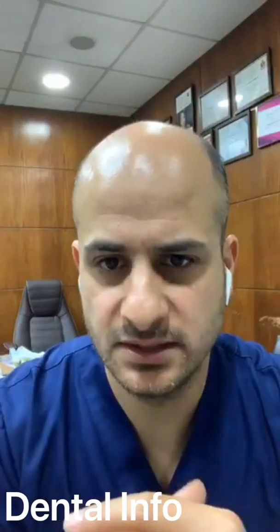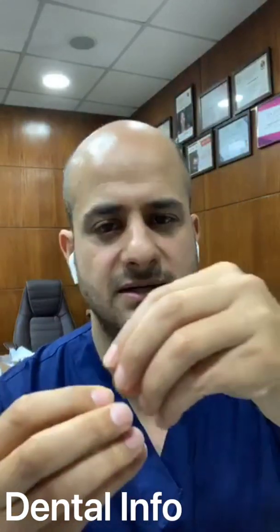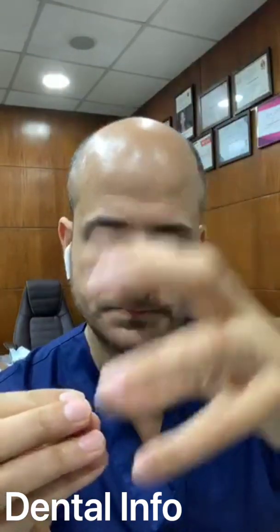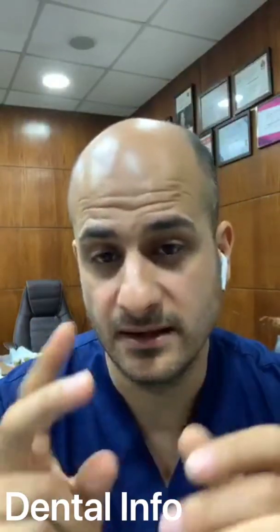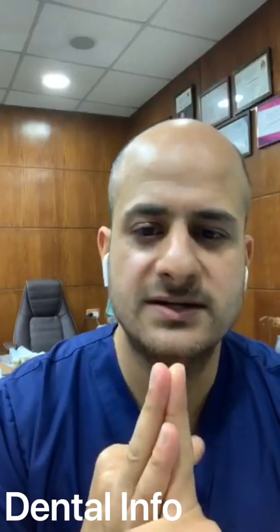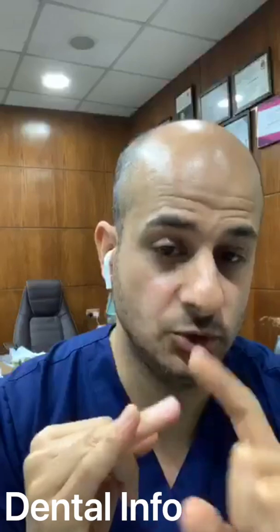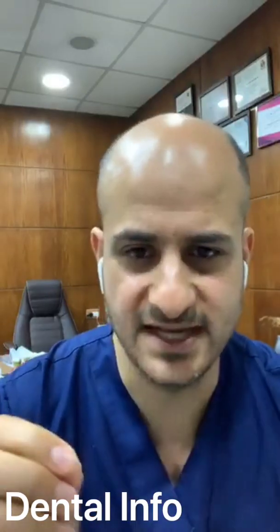How can we avoid sticking between gutta-percha and the plugger? I think Dr. Dua Halima is asking about when she goes out with the Fast Pack, the gutta-percha will go out with it. Okay, it's a common problem. We have a lot of causes. First, you don't have good tugback. Second, you are trying to pull out your heated plugger, I mean Fast Pack in this case, in cold position. So you have to heat it and pull it out. And you have to have very good tugback.